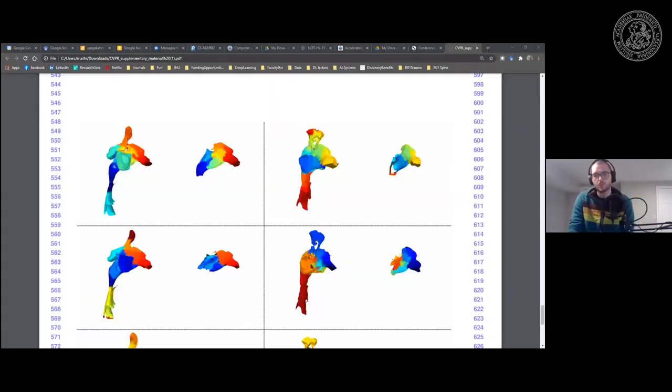And what we're doing here, and I probably need to go in here small enough so that I'm not giving away too much, is that we've been trying to solve this type of problem again as a registration, now in 3D space. To solve that specific problem, we're thinking about, again, correspondences between the different models.